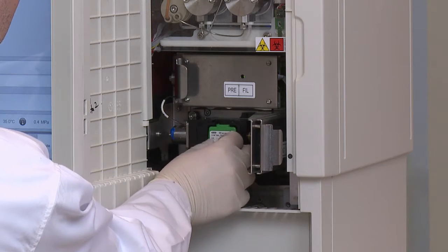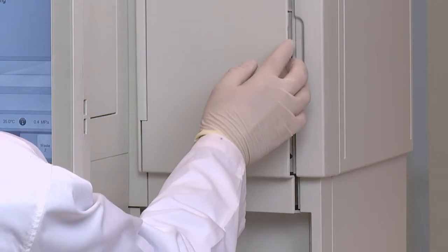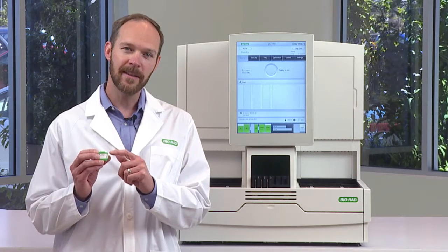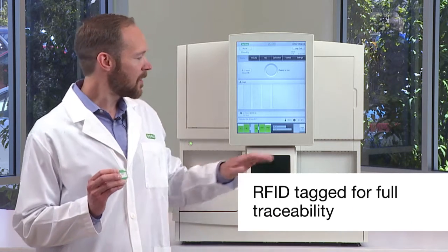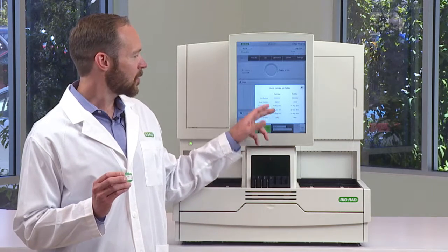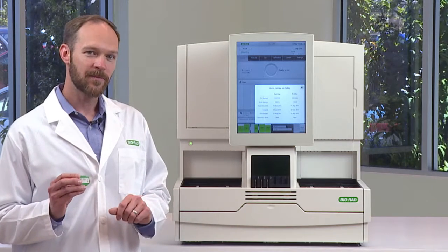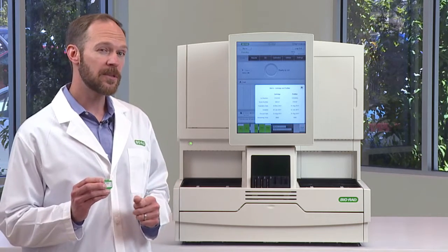You open the cartridge holder door, snap it into place, and close the door. When you close the door, the system will read an RFID tag that's embedded on the front of the cartridge. That will transmit all of the necessary lot number, expiration, and test parameters, which you can see here. So there's no need for the operator to enter anything manually, and you get full traceability.